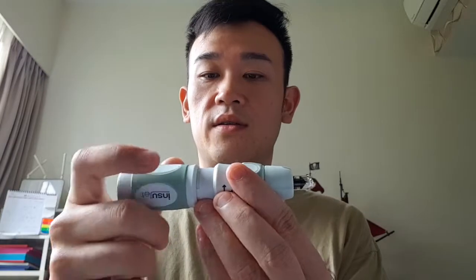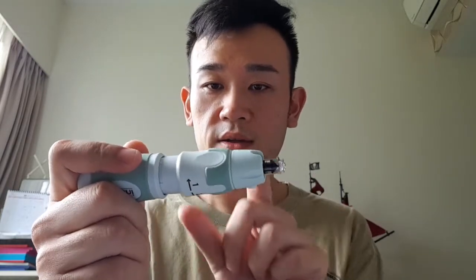A drop came out. Usually the head doesn't attach very closely to the skin, which can cause bleeding. Some users hold the pen like this, so it becomes detached on the injection side versus the skin side. What we do is usually hold the top part here, so this middle part can compress and we release like that.